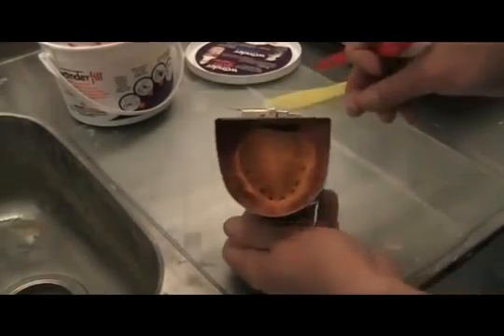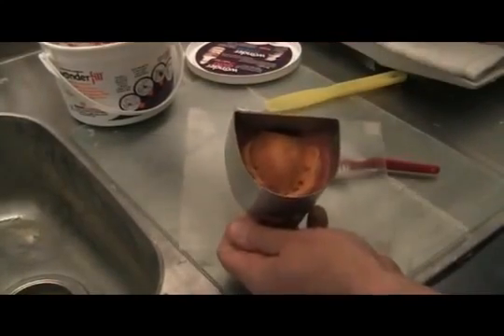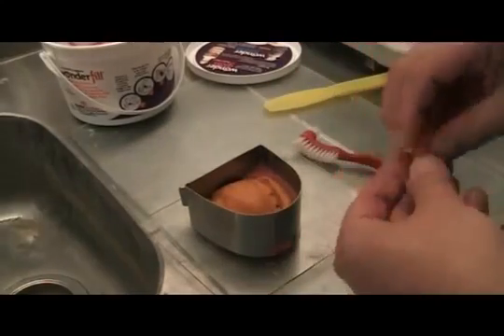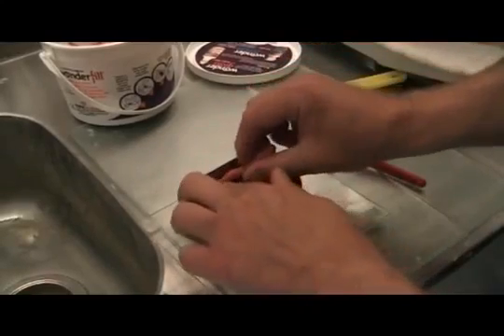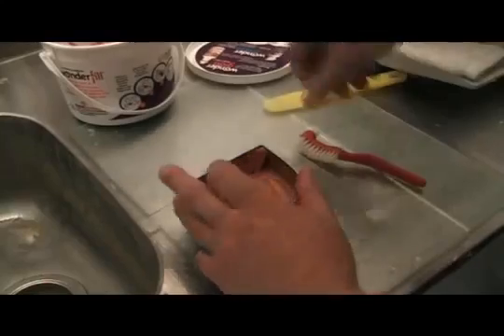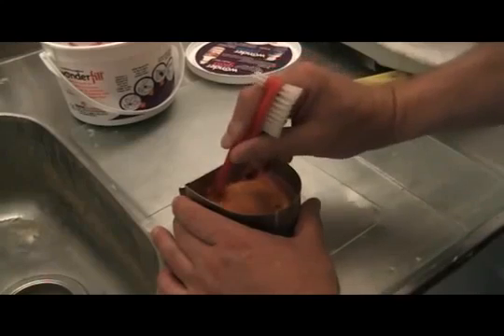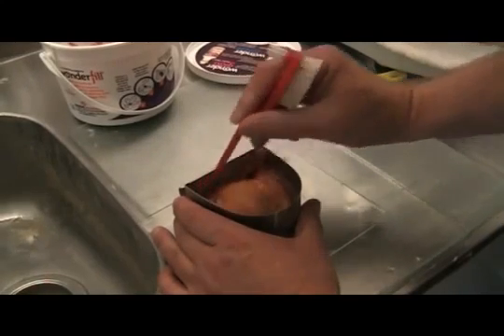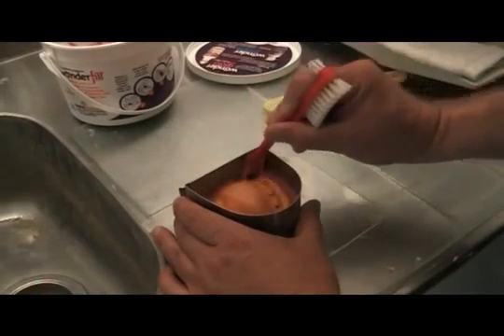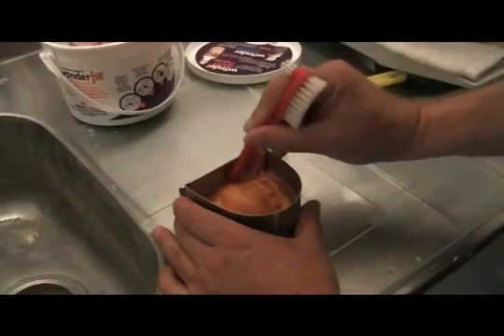Anyways, what I'm doing is, as you can probably see, I'm tamping it down. I have a void here, so I'm going to grab a little bit more material and press it into place to fill that area. Again, what I'm doing is going just subsurface of the impression rather than being above it. Negatives equal positives, positives equal negatives in impressions. So the same thing would happen with the land areas. You have to make sure that we don't create positives in the impression, or negatives I should say.